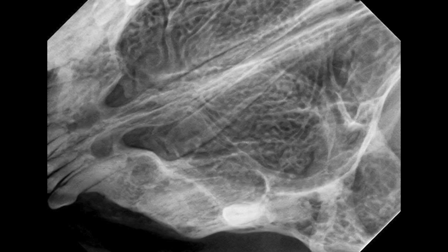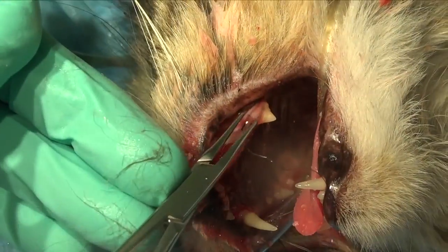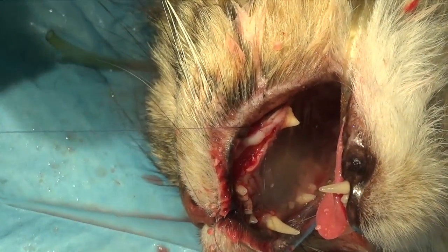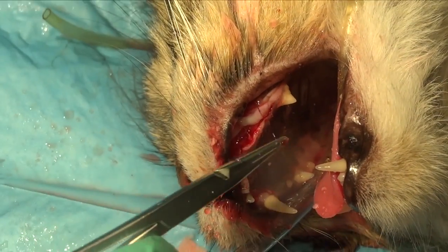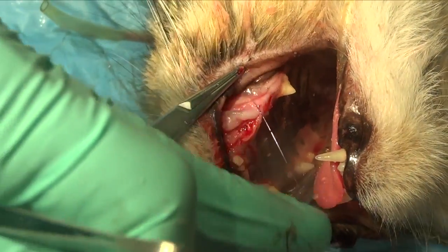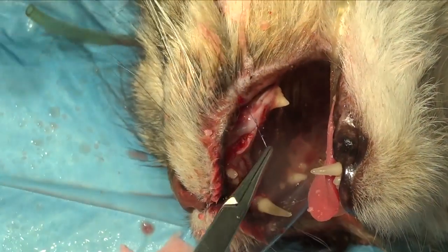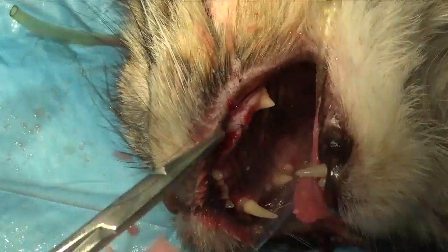Here's what the finished product looks like. You can see we've got a nice smooth interface there. The sutures will start caudal moving rostral. And again, that's 5-0 monocryl — very nice through the tissue, no drag at all, and knot security is excellent with this suture. Multiple simple interrupted sutures with large bites.